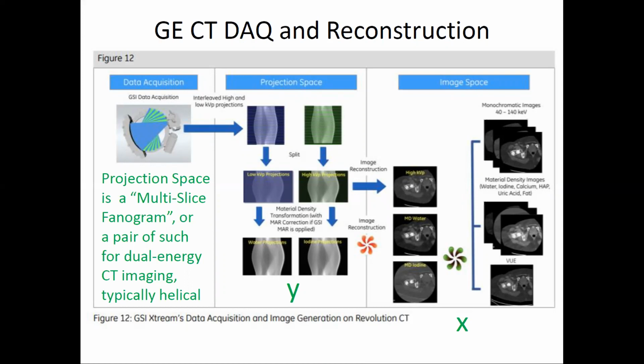That's just your mapping from your radon transform, your cone beam transform, from the source to the detector position, and then the detector moves and you get a new one. So you can represent your array of values. For each angular position, you read out an array of values. Then you rotate to the new position and read out there, integrating the times in between. That's how you get this series of frames, which is the form your raw data takes. That's your projection space data. Projection space data has corresponding image space data, and you're trying to produce an image from this projection space data, which is solving the inverse problem.